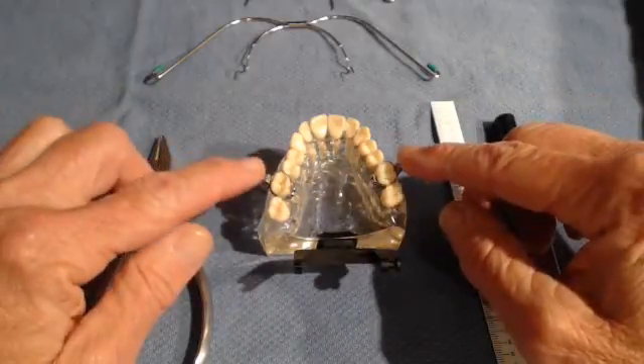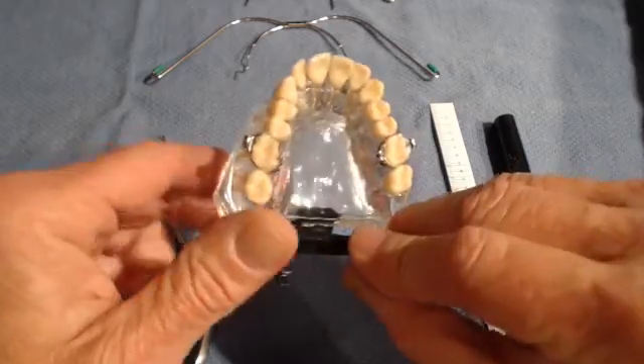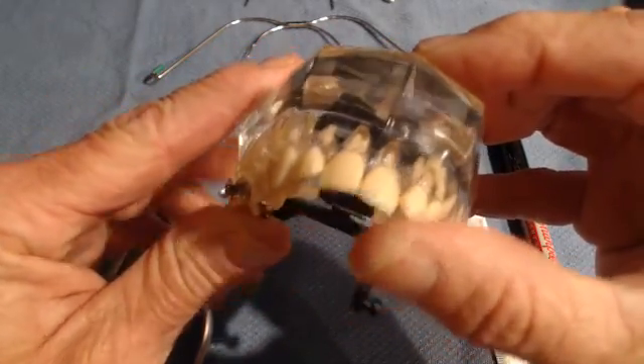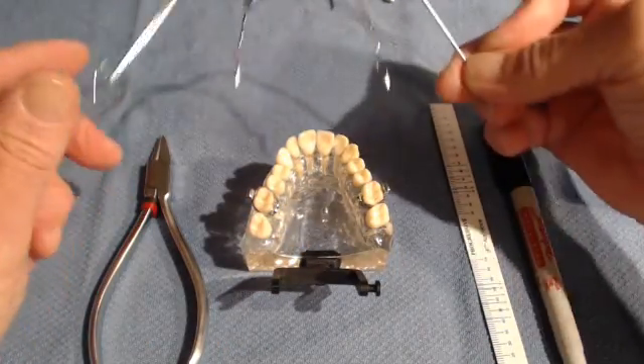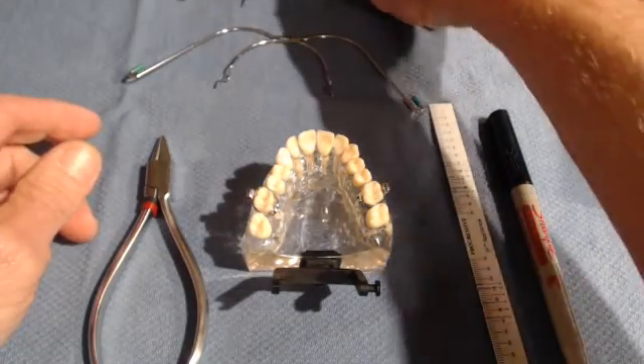The first step is to have bands fitted on your upper molar of your patient with headgear tubes — that's the 0.045 headgear tube. You have to know if you're using a cervical headgear: this is the face bow for cervical versus a high pull headgear.